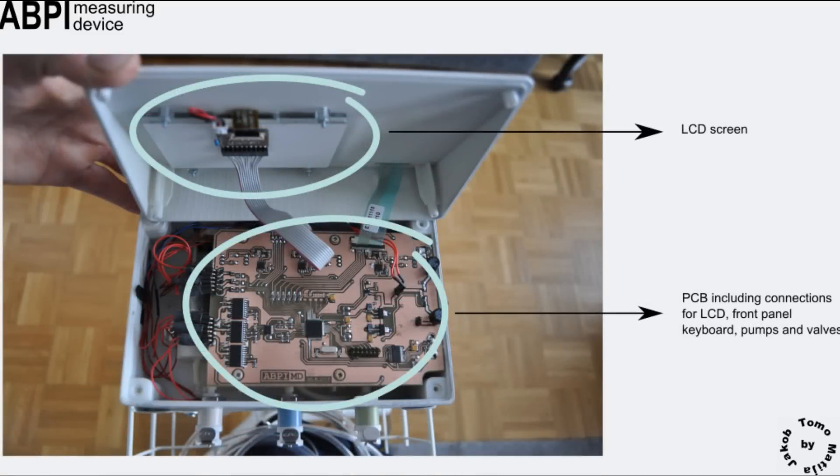Inside the plastic housing there is a printed circuit board with an MSP430 microcontroller, pressure sensors, low pass filters, amplifiers, switching circuits, digital to analog converter, connections for the LCD display, foil keyboard, power supply, USB port, pumps and valves.